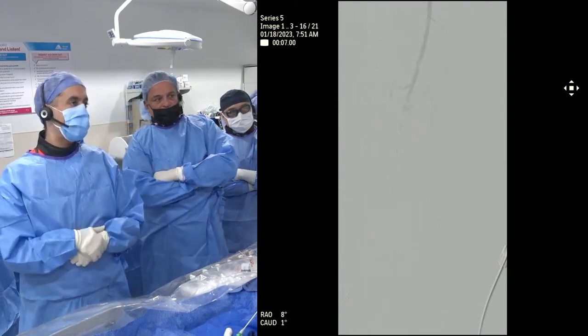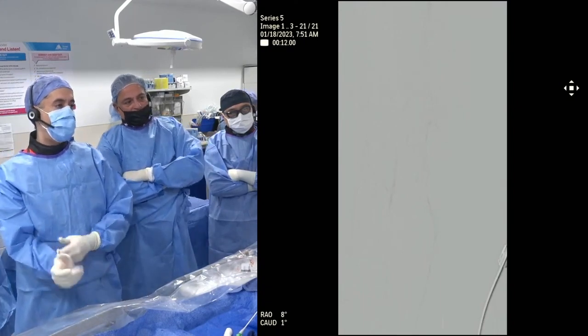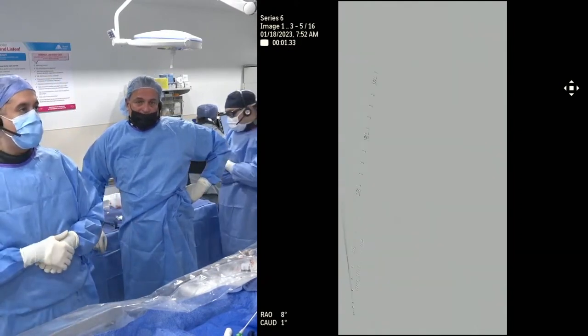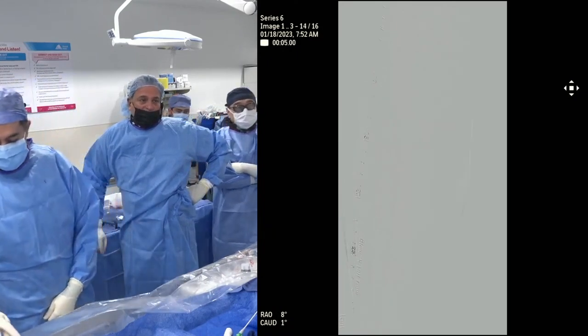And this is where I think she's gotten worse because of this. It's definitely progressed and now really occluded at the level of the pop, or maybe underfilled, we don't know. And then distal is one vessel runoff. Correct. So now, Srini, we interrogated the posterior tibial, very calcified, completely occluded.